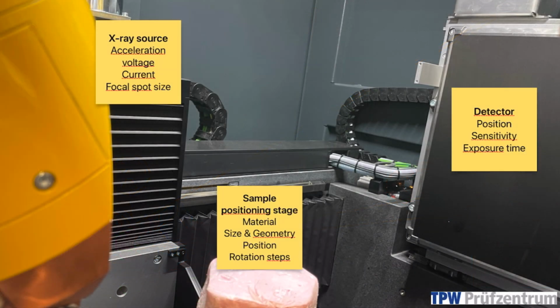So with this, I'm coming to the end of my video, which only covered the hardware side of CT imaging. Talking about reconstruction and software analysis will be a totally new chapter in the world of CT imaging. But as a first step, of course, it's important to understand the hardware side of the process, and this is what I meant to explain.